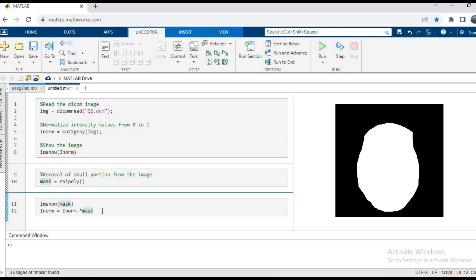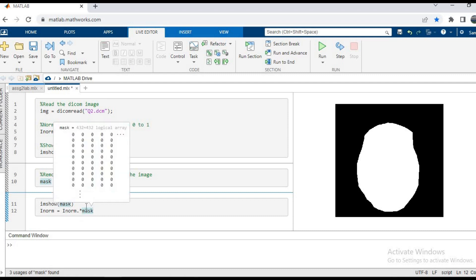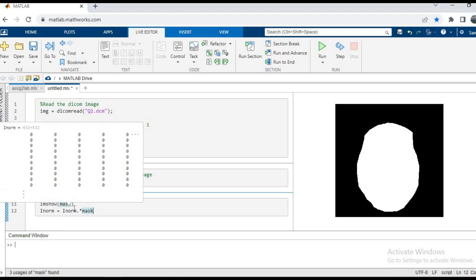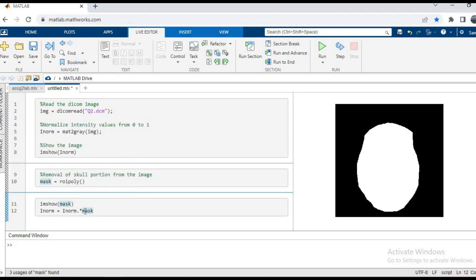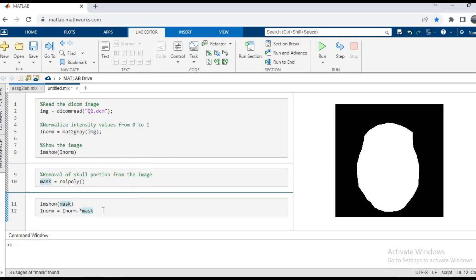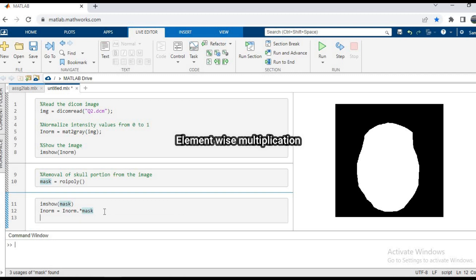We have written this code: inorm equals inorm dot multiply mask. This line of code means we're updating inorm and multiplying it with the mask. This multiplication is not vector multiplication or matrix multiplication because there's a dot before the multiplication symbol, and this means there's an elementwise multiplication.